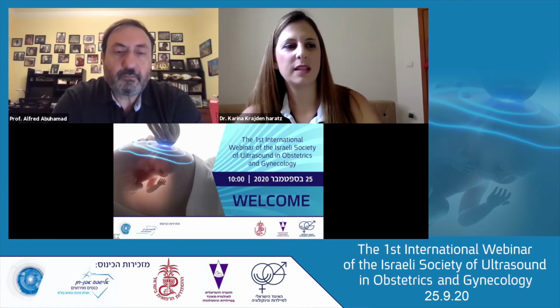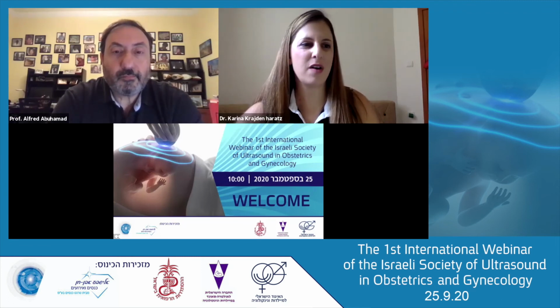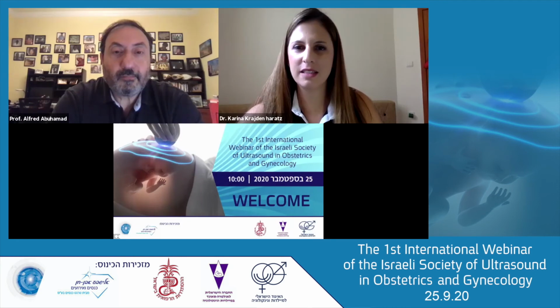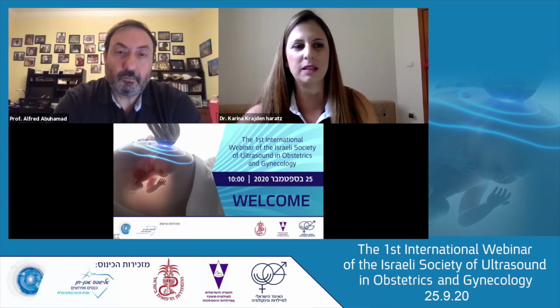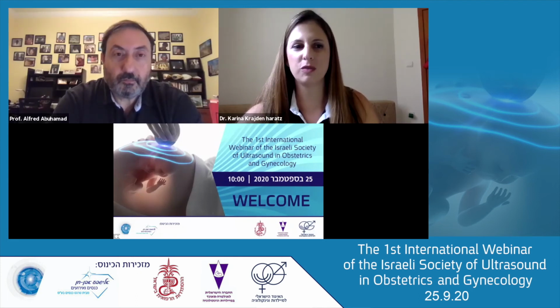Thank you. And a question from Dr. Rambul Seski from Haifa. Here in Israel, we perform our early scans, preferably using transvaginal route, either at the time of the nuchal translucency, but here more often between 14 and 17 weeks. So we would be happy if you tell us your opinion on the contribution of the transvaginal route for the early diagnosis of the cardiac anomaly.